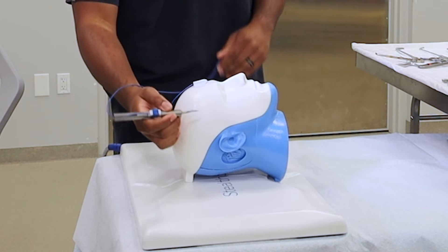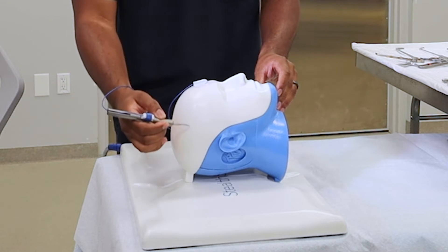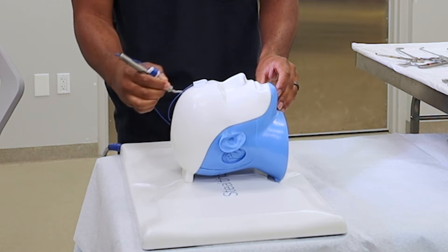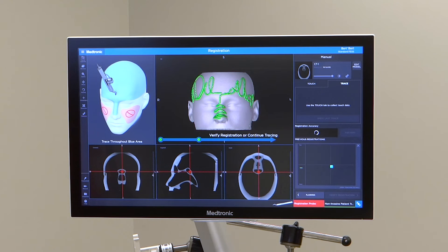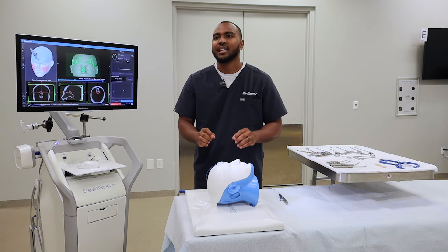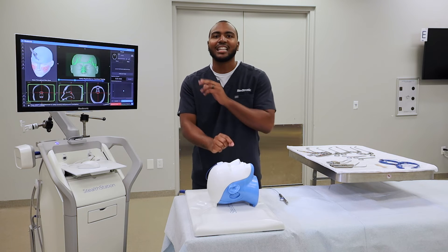I'll demonstrate now. Hold the registration probe to the skin for two seconds, then collect points all the way back by the ear and up on the forehead. That quick chime means you've reached minimum trace — then continue all the way down the bridge of the nose. Once done, press and hold the probe to the skin for two seconds until you hear the last chime. Many people like to lift the probe out of the field and hold it to the skin until they hear that final chime.